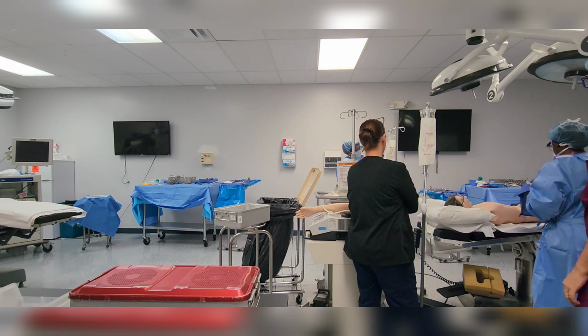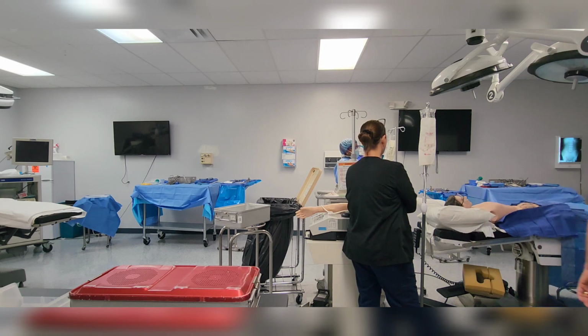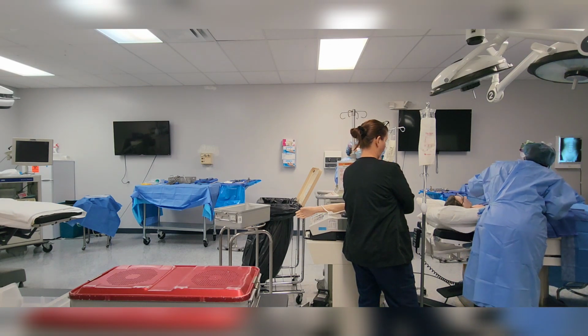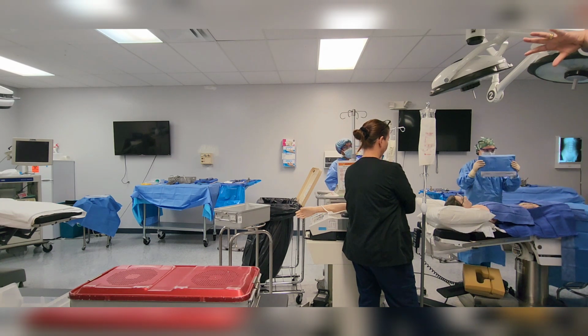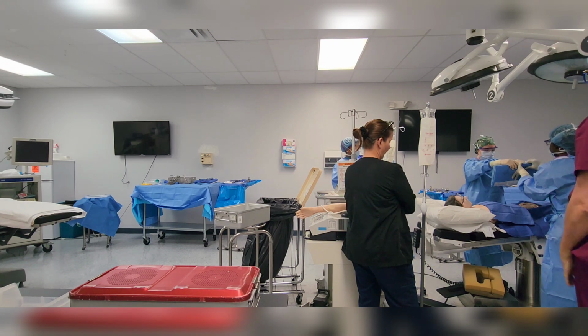Do nurses do this? No, nurses aren't scrubbed in. As a student, you probably won't do this, but once you're an employee and you've been doing it for a while, they're going to have you drape. Do you do it with the surgeon? Usually, yes. Most surgeons probably will, but some are in another room finishing up, and they want the patient to come in, and all they want to do is come in, scrub, and start. So they expect experienced people to do that.